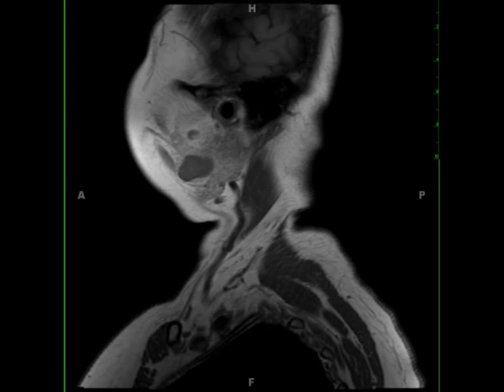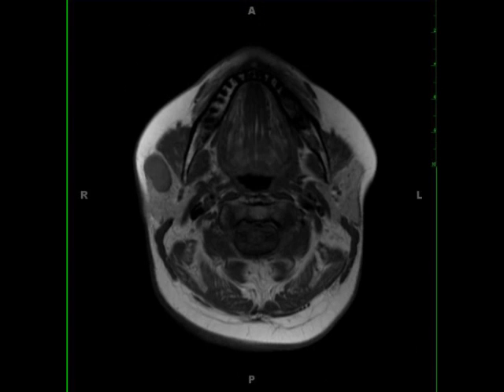This is a 54-year-old male with right side facial swelling. There is a circumscribed T1 hypointense, T2 STIR hyperintense, enhancing retiform-shaped mass arising in the superficial right parotid gland, which restricts diffusion.